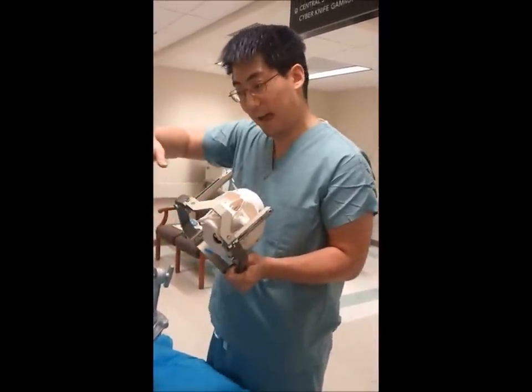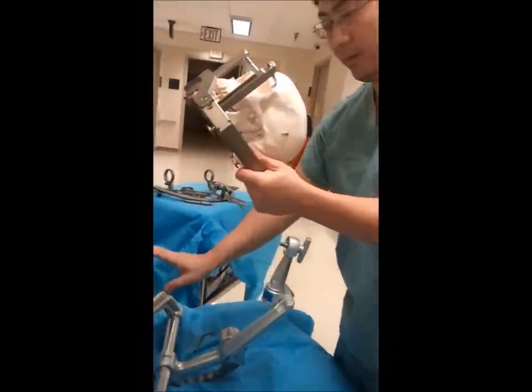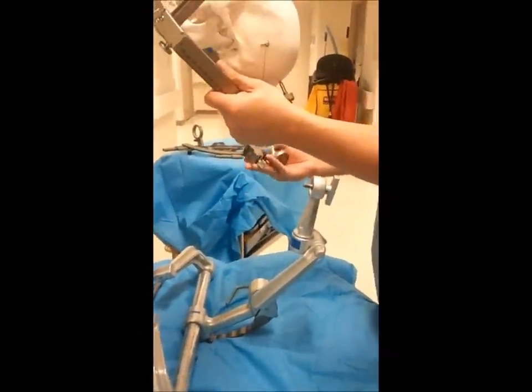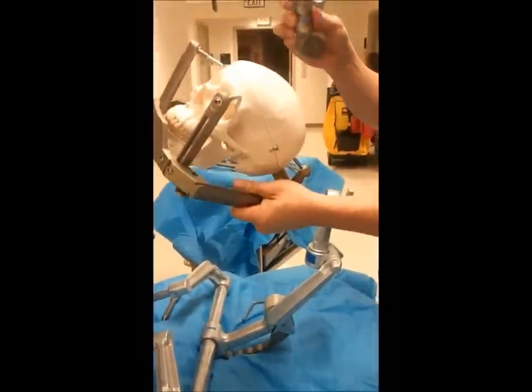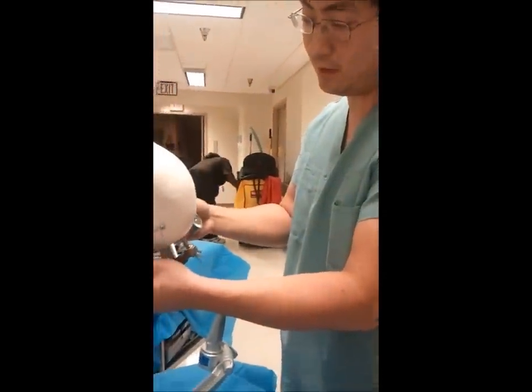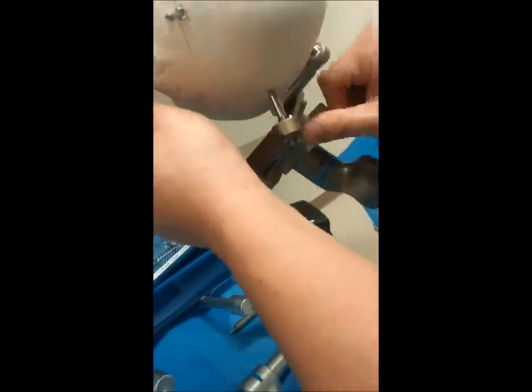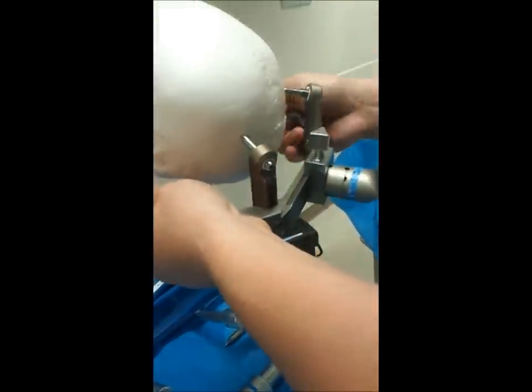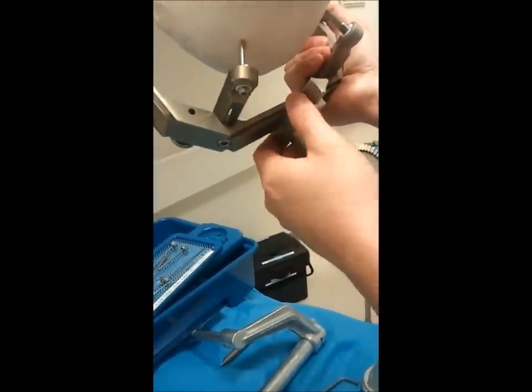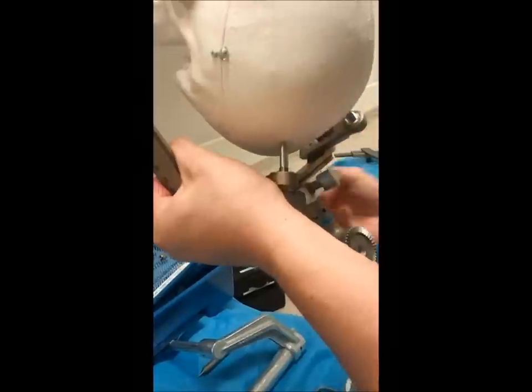We'll take the head of the bed off, bring the back up, and now we'll take this Leksell frame of the patient and with the Mayfield regular adapter with the swivel on it, we will have the patient's head suspended in the air. Then slide this Leksell swivel adapter for the Mayfield onto the back. That can be variable — there's no specific coordinate that it needs to be at.